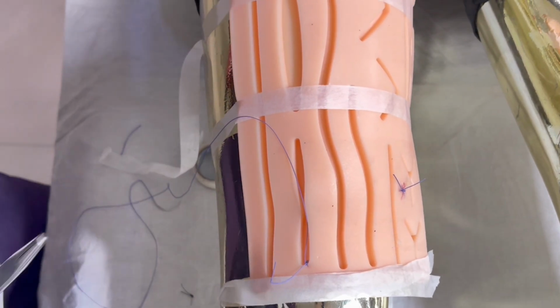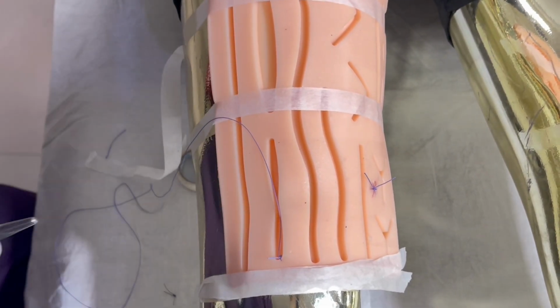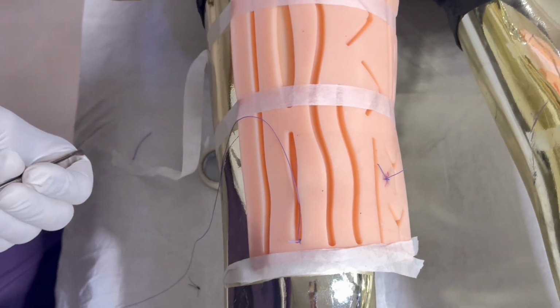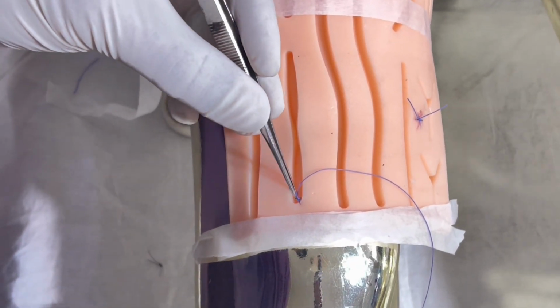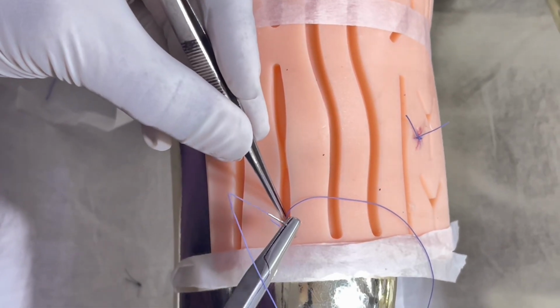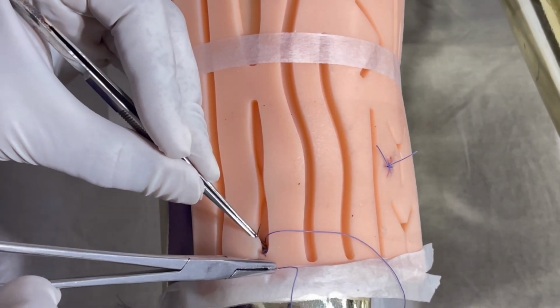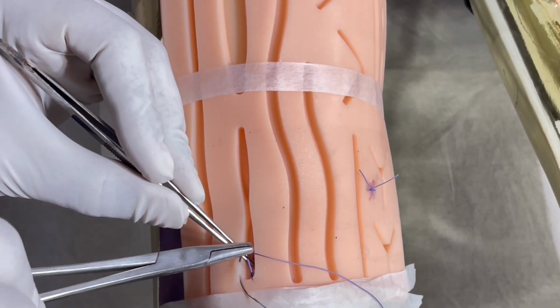So this end will be cut, and so this knot is going in. The stitch has to be taken in a subcuticular way.